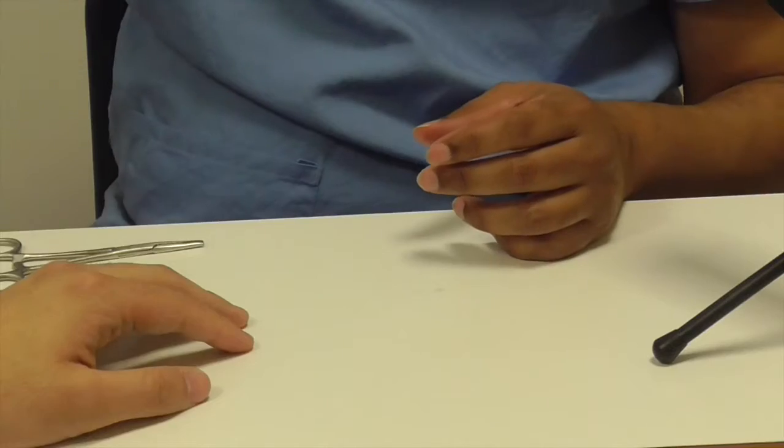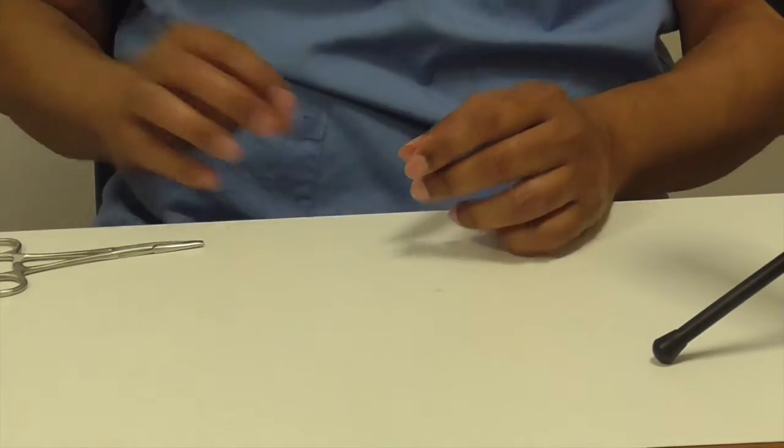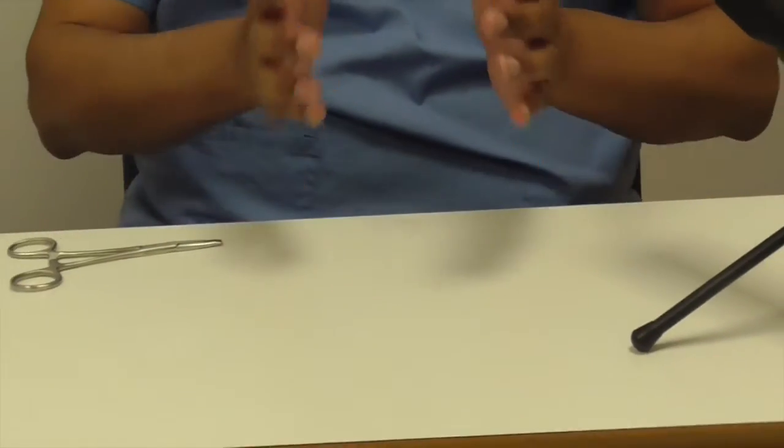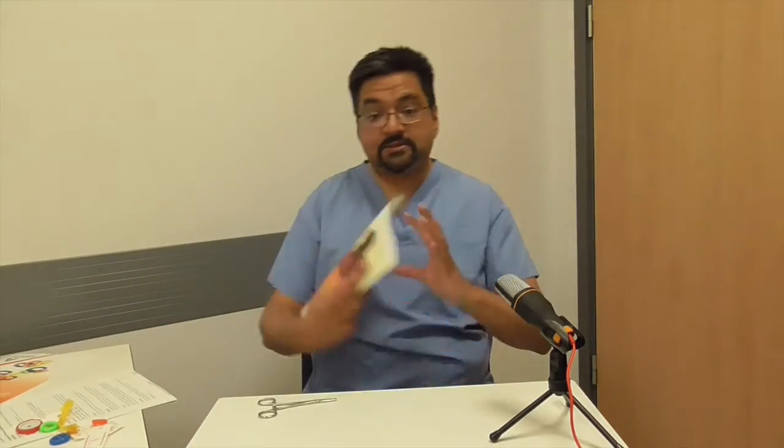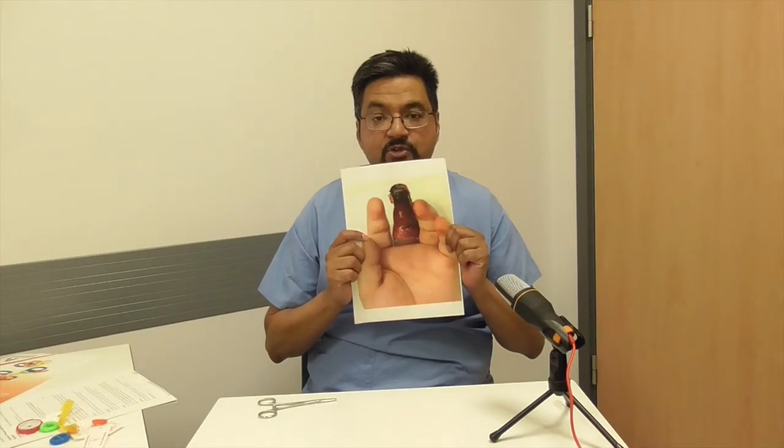So, digital tourniquets are a very good tool for finger and toe surgery and an important part of the surgical process — they create an exsanguinated, bloodless field. But please use them safely, because you don't want to be the person who ends up with a patient with that sort of finger. Thank you very much.